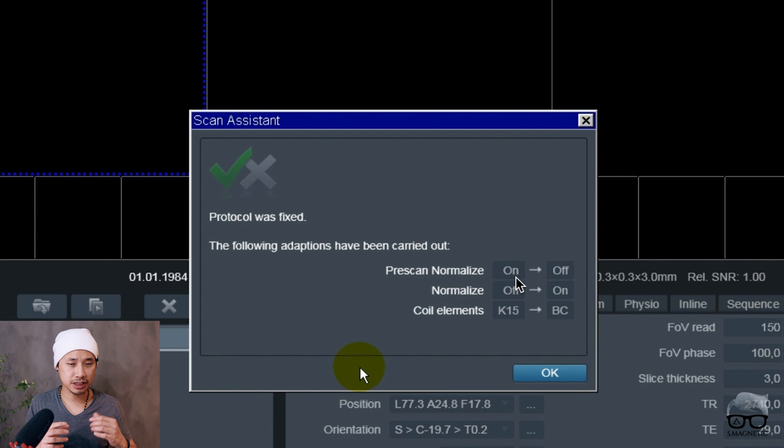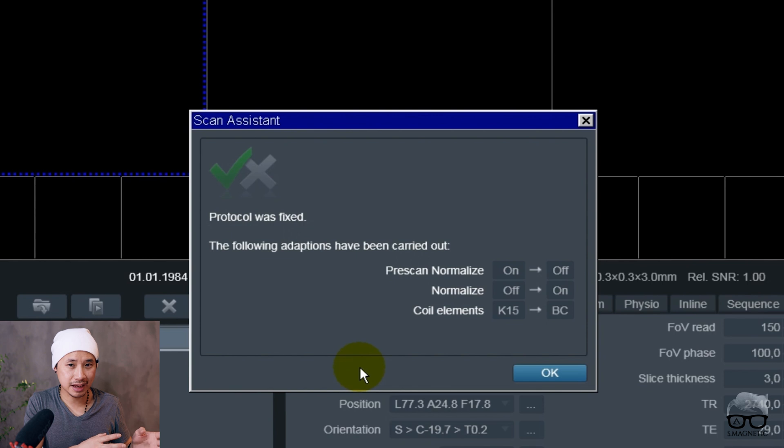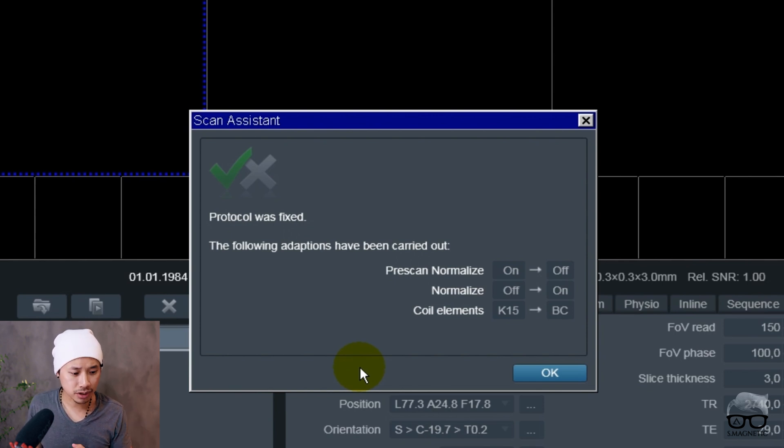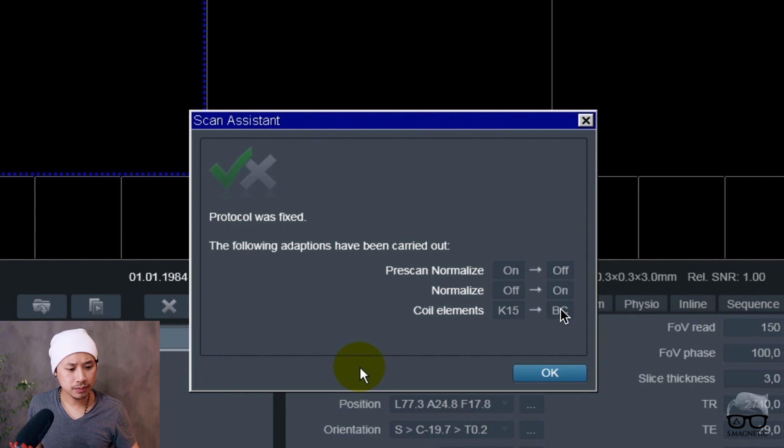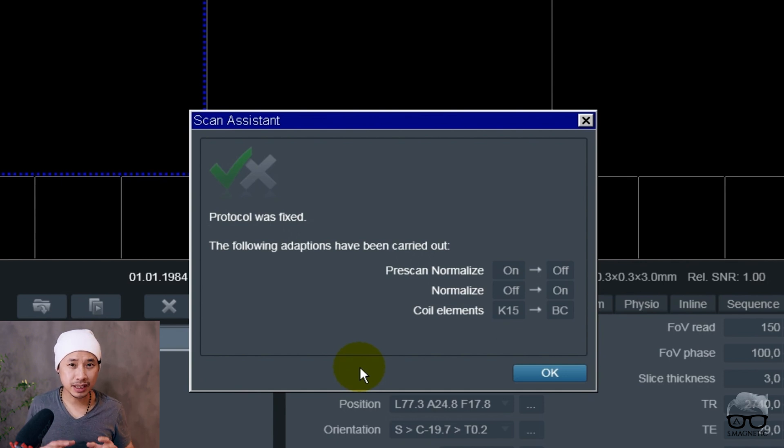One of them is the pre-scan normalize. It's going from on to off because it just detected another coil. The knee coil was saved but now we're using the ankle. The system detects it and the pre-scan automatically turns off and then normalize goes to on.